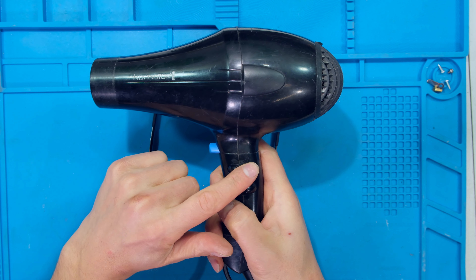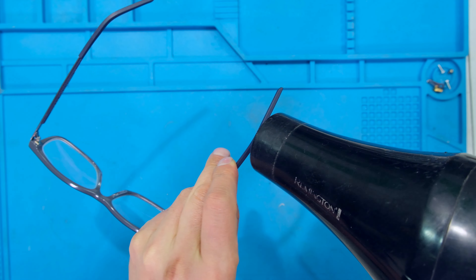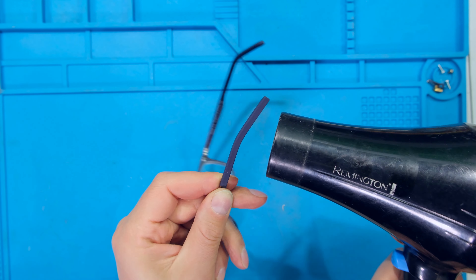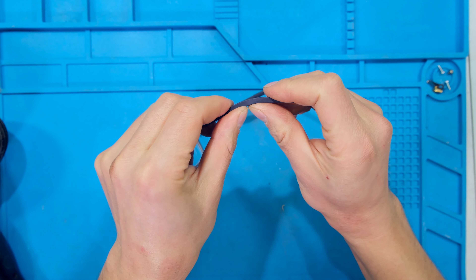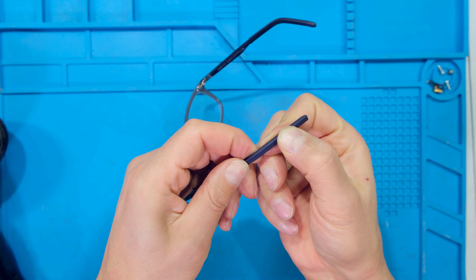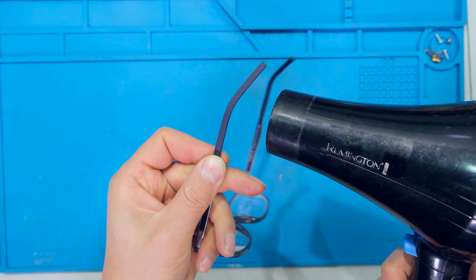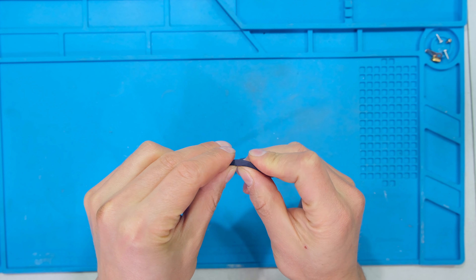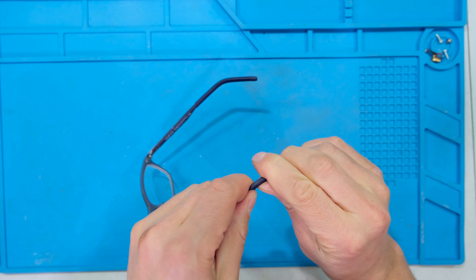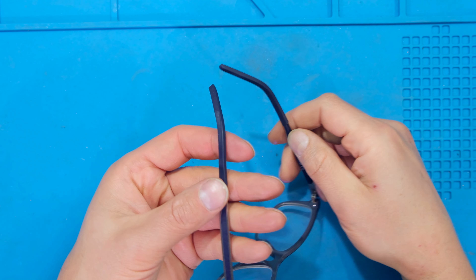If you don't have a heat gun you can also use the hairdryer — I've set it to the maximum heat and now I just turn it on. While it's still warm I bend it — notice I'm bending it slowly and then bending it inwards and down. It's almost bent enough. Now both sides have been bent inwards and down.